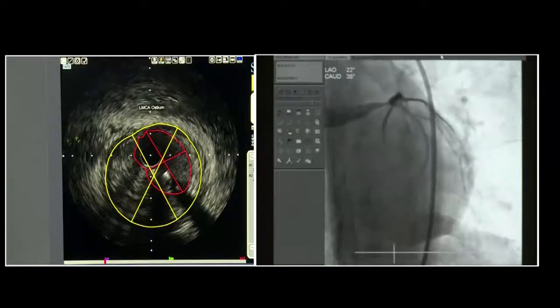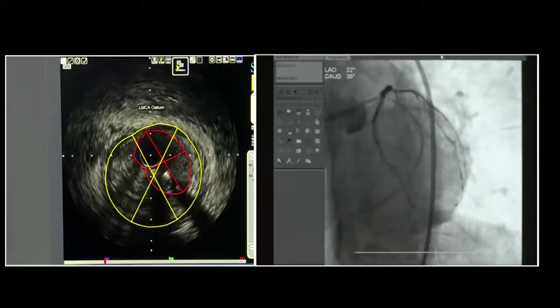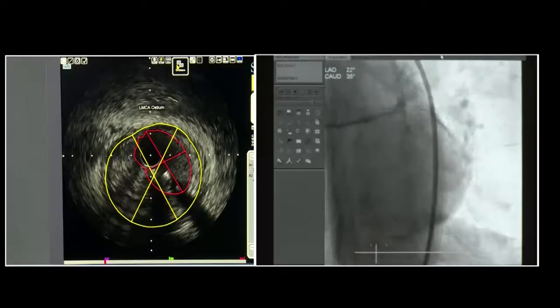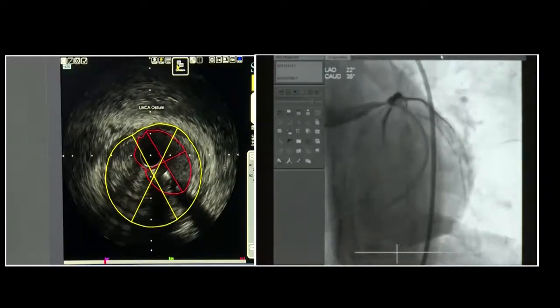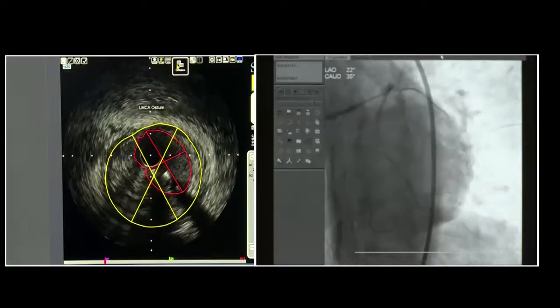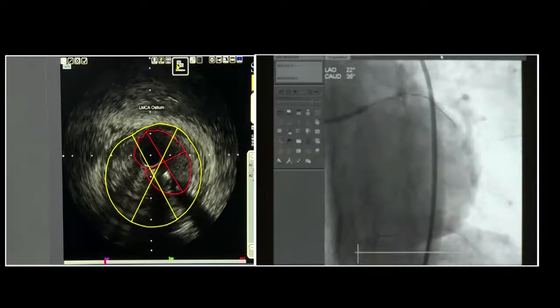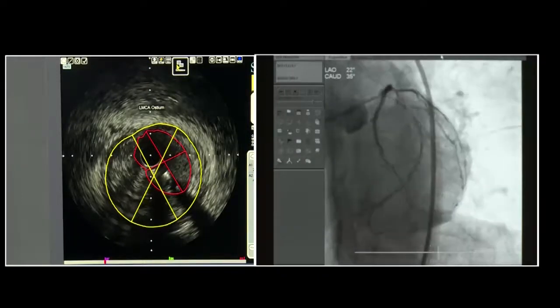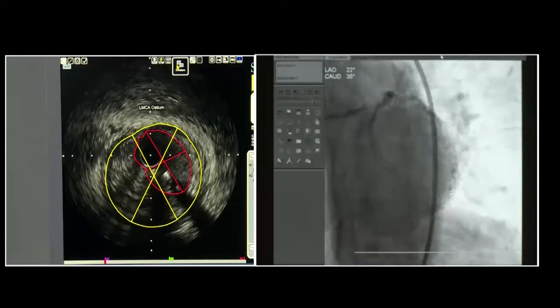Although it looks okay in the side branch, it was diseased and extending more than 2, 3, 4, 5 millimeters. That means you need a two-stent technique. So does anybody disagree? As far as here is concerned, everybody is agreed on two stents, we are committed to a two-stent technique, sir? Two-stent technique, okay.